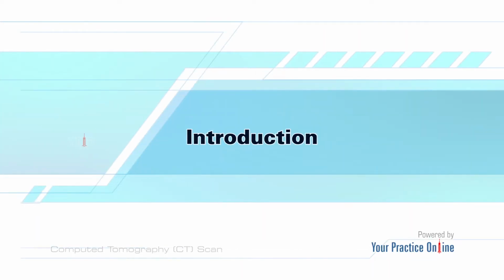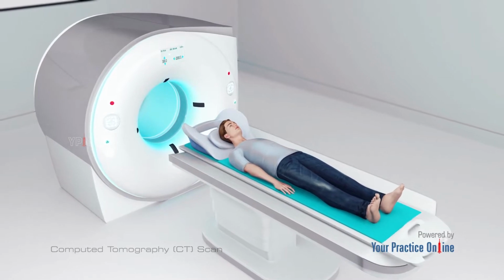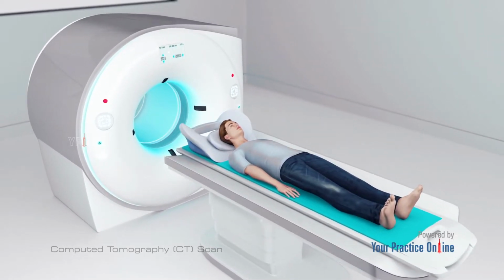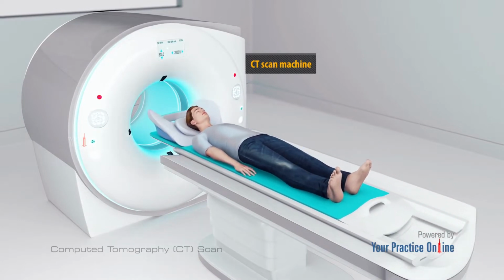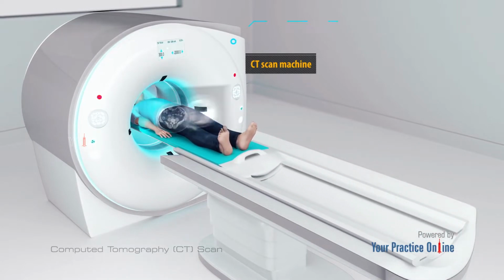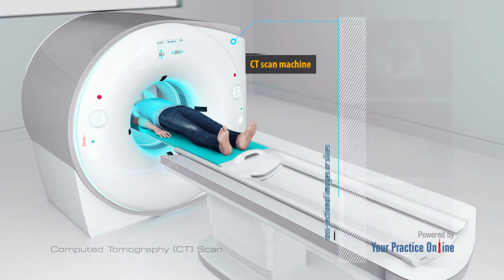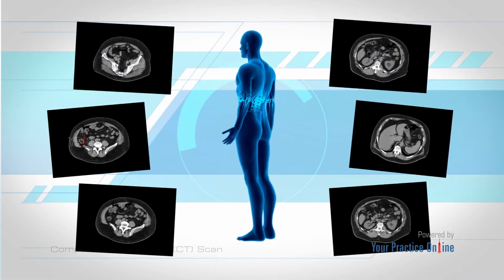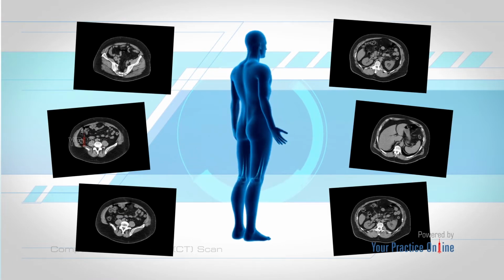Introduction. A computed tomography scan, commonly called a CT scan, is a non-invasive medical imaging technique that uses a specialized rotating X-ray machine connected to a computer to obtain detailed cross-sectional images of the tissues, bones, and blood vessels. A CT scan is a painless procedure which lasts around 15 to 30 minutes and can be performed on any part of the body.